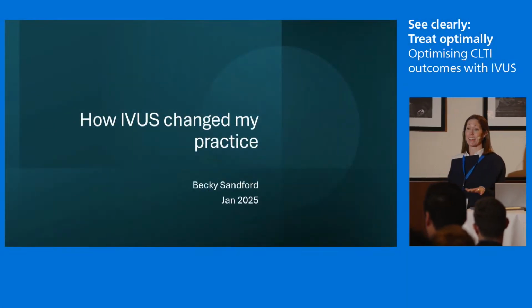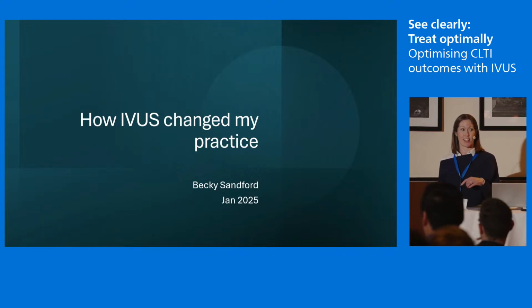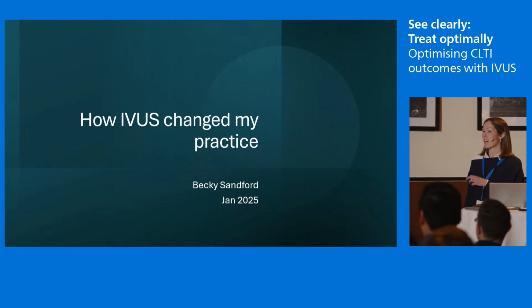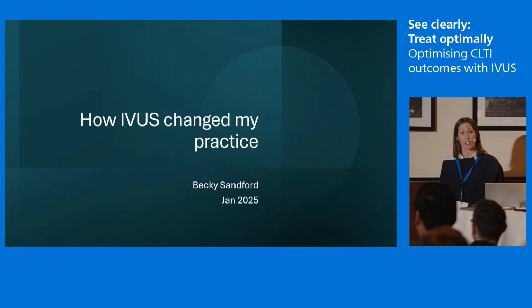Thank you very much, NT, and thank you to Philips and Ash and NT for inviting me to talk. I have to say I feel a bit of a fraud. As NT says, I am very much not an expert either in IVUS or in peripheral endo or in CLTI or anything else. I am a general jobbing vascular surgeon. But I guess my role is to say, well, even within that generalist practice, how have I come to adopting IVUS, and in which cases, and where is it useful on that early point of a learning curve?